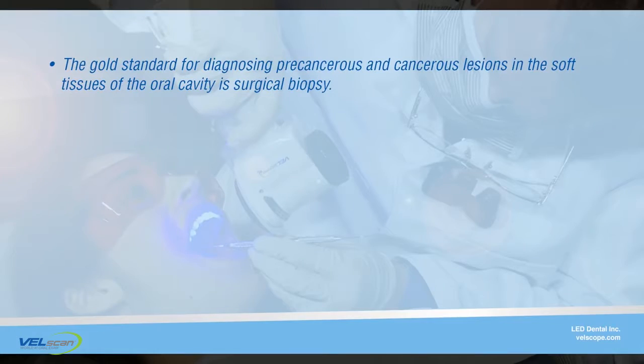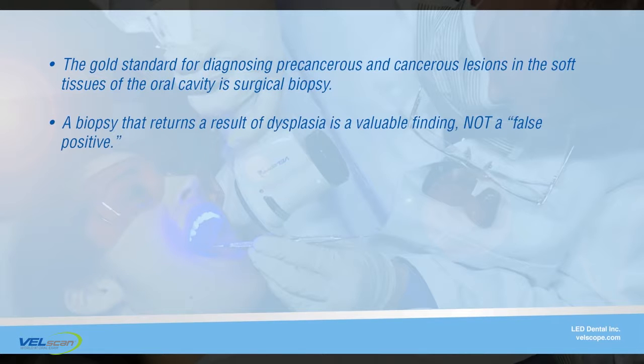If the patient cannot make a follow-up appointment, or if the dentist feels that the patient is unreliable, immediate steps are advised. Remember, the gold standard for diagnosing precancerous and cancerous lesions in the soft tissues of the oral cavity is surgical biopsy. A biopsy that returns a result of dysplasia or any other pathology is a valuable finding, not a false positive.